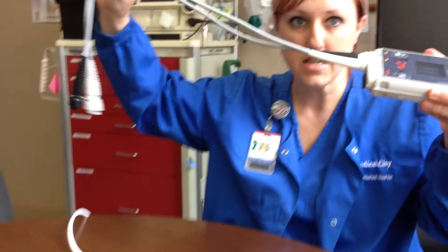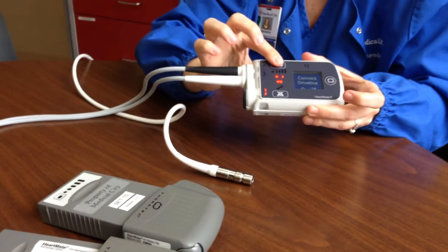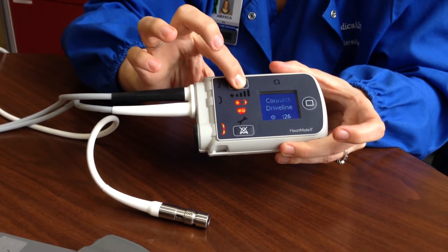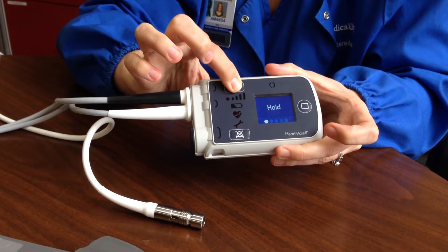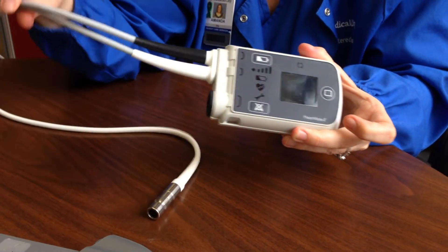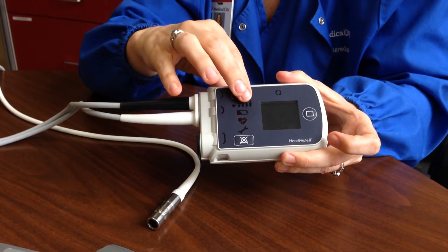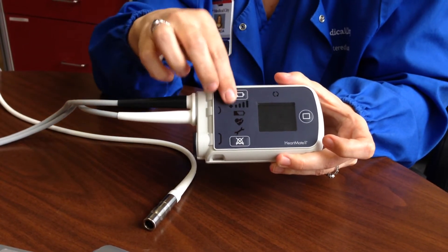Now you're completely disconnected from the patient and from the power. At that point you can turn the controller off using the battery button on top — hold it and let it count down until it's off; it'll show you the countdown on the front. Generally, if I'm able to, I'll take this out of the room before turning it off because the alarms can be distressing. If not, I'll pass it off to somebody who can take it out of the room and turn it off.